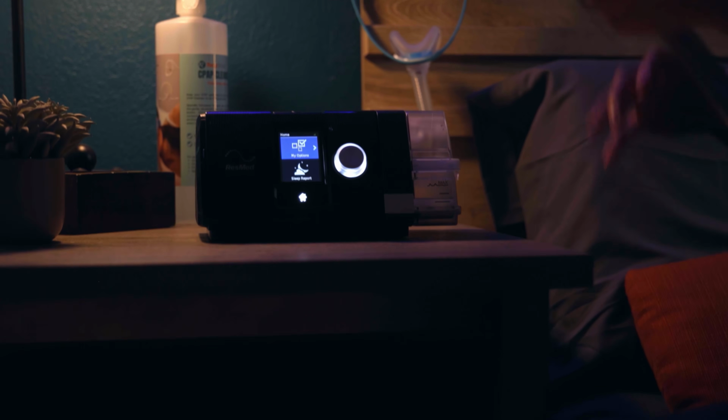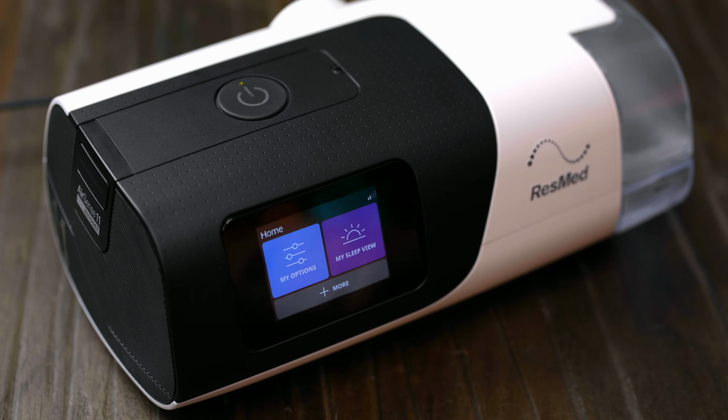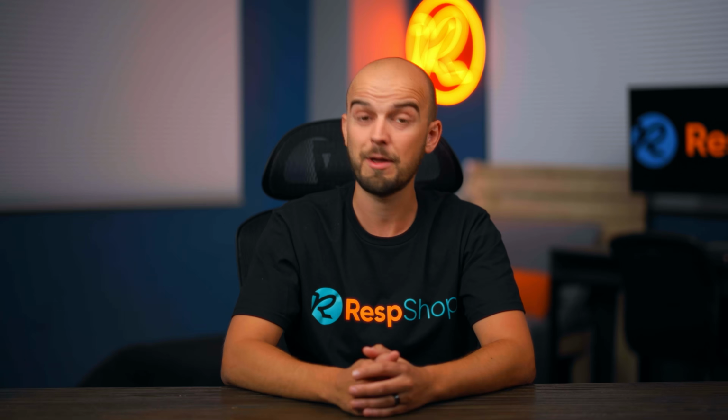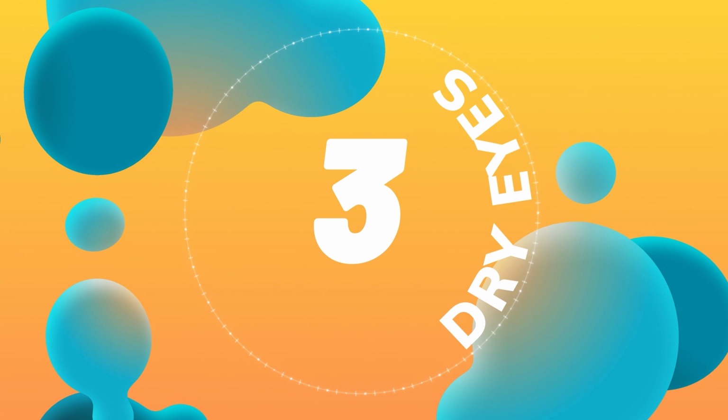And they aren't a great expense if your machine has the feature to accommodate one, so we'd recommend you get one. Finally, if your machine supports preheating, use it. That will ensure you get warm and moist air delivery from the moment you put the mask on. Just remember to activate it about a half hour before you plan to sleep, and don't forget about it once you have it on. Problem 3, dry eyes.